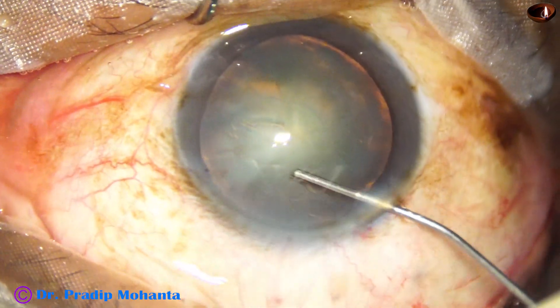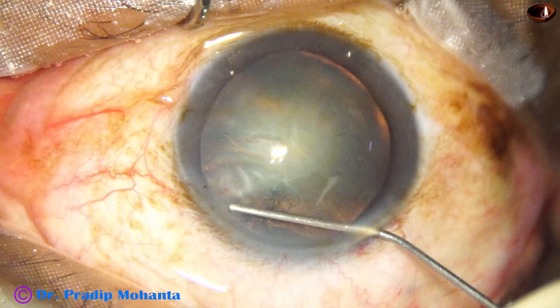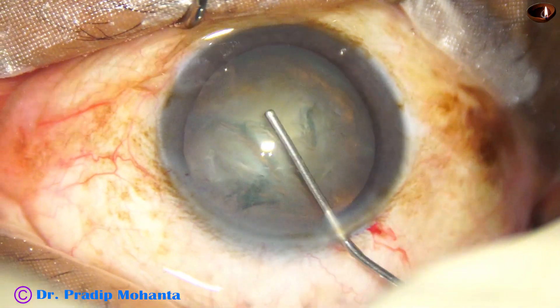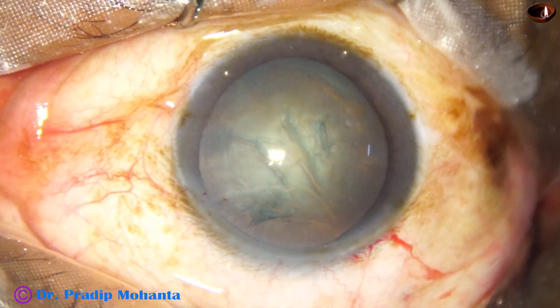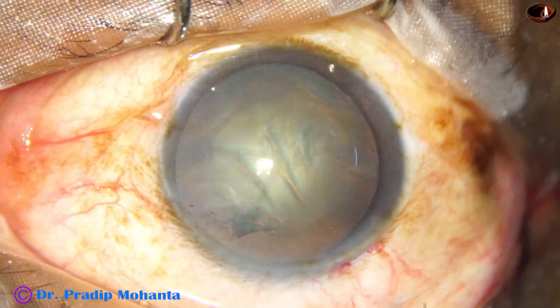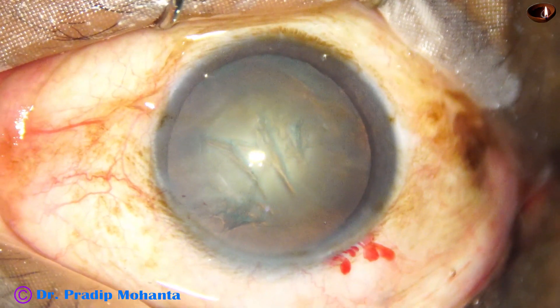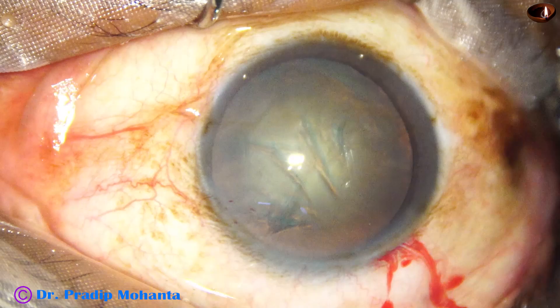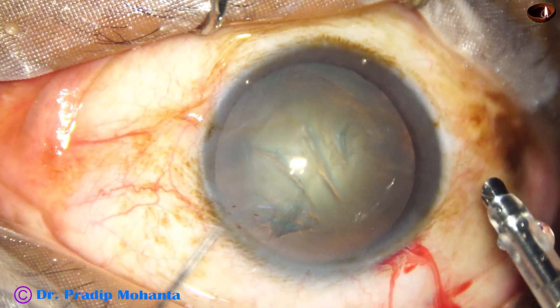And now, this is hydro-dissection with a 27-gauge cannula and BSS. And now is the time to do a mechanical chop.